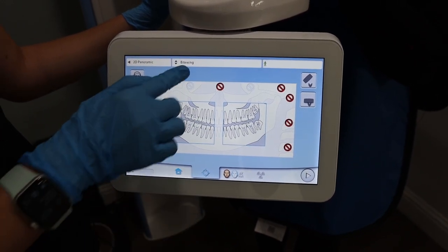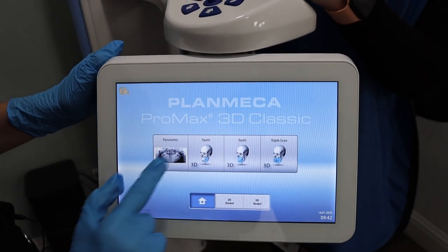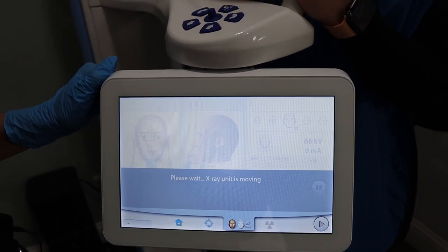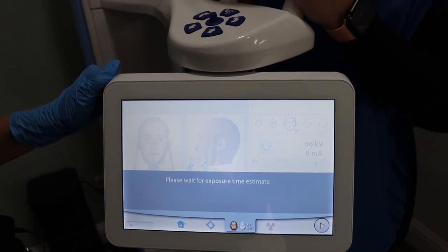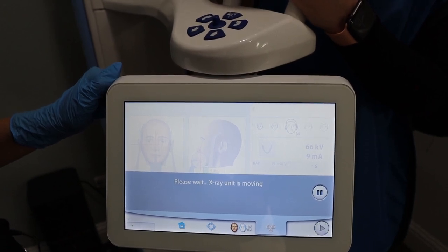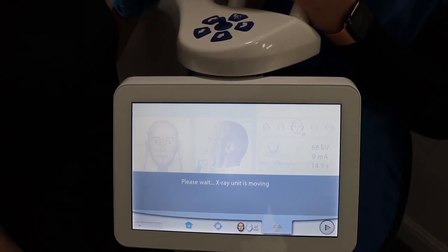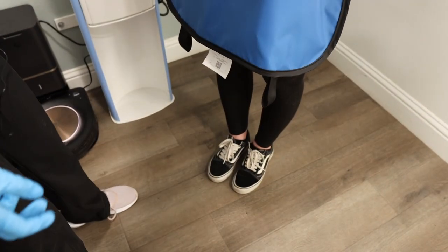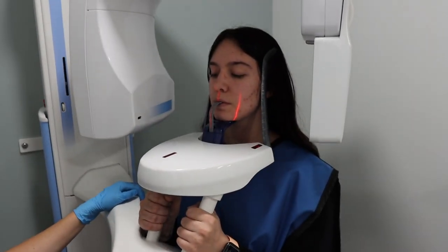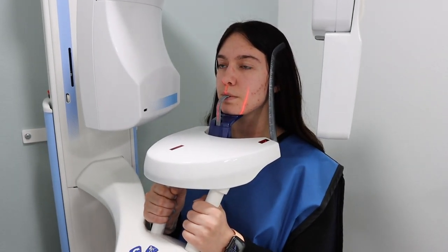You're going to click the panoramic button, then click the play button, and then click the play button one more time. You're going to instruct the patient to take one small step forward until they feel your foot, close their lips around the stick, press their tongue to the roof of their mouth, and to swallow. Now we're ready to take the pano.